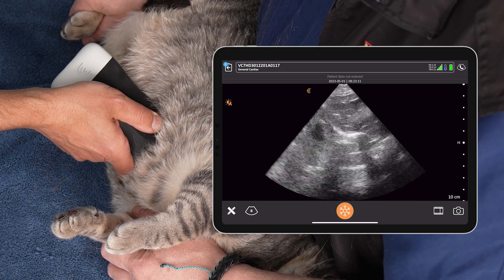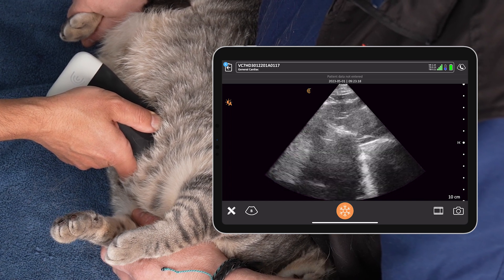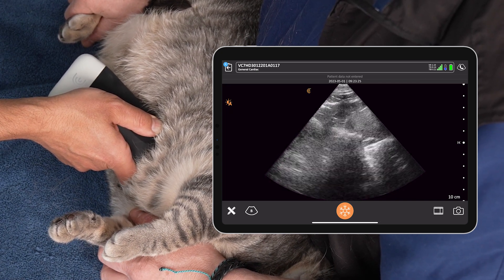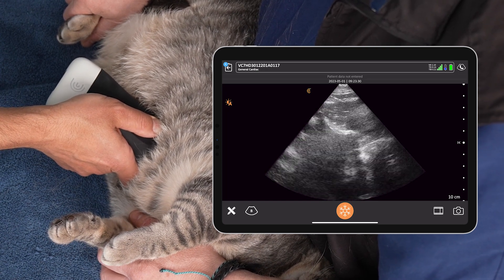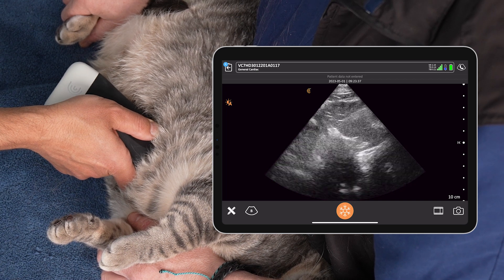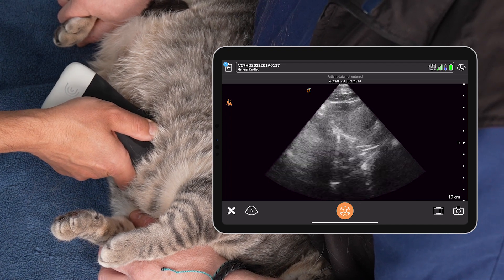We also see the caudal vena cava there, which is another thing we want to assess. What are we looking for specifically? In cats, we want a change of at least 20 percent with respiration — we can see the change in the caudal vena cava diameter there, which is a normal caudal vena cava. In this case we also see a really nice cardiac pulse back to the level of the vena cava — you can see that pulsation with the heartbeat. We don't always see that in our cats, but when we do, it is also a normal finding.